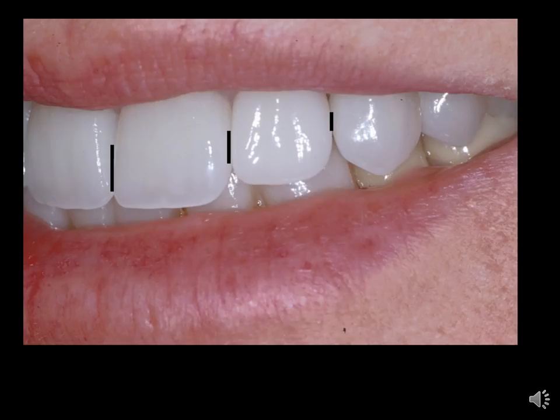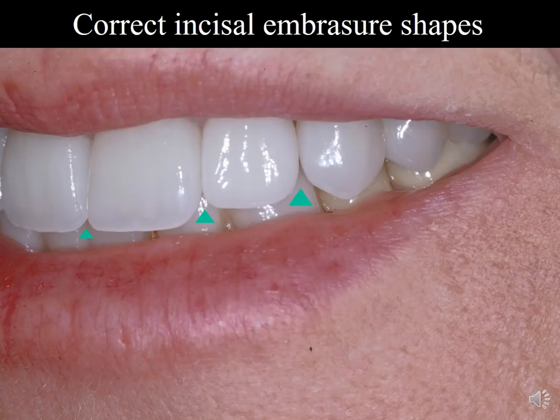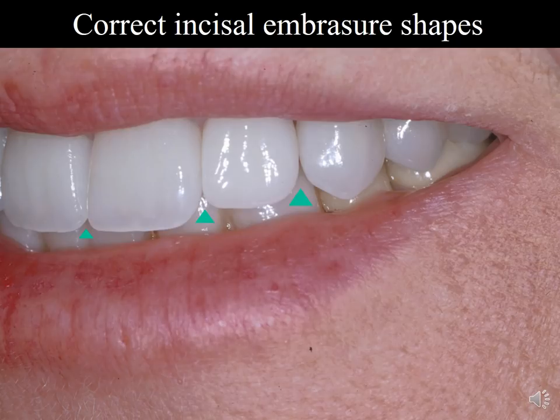We need to pay attention to the shape of the embrasures on the incisal. Notice how it varies as we go distally — it becomes broader. These subtle little differences make a tremendous difference in the outcome of what we're doing.